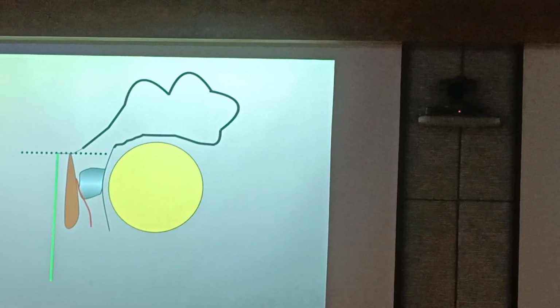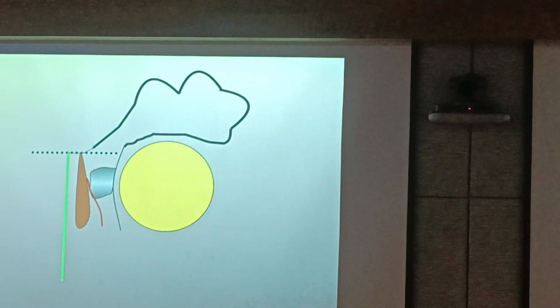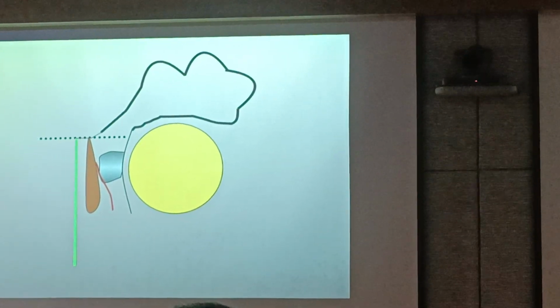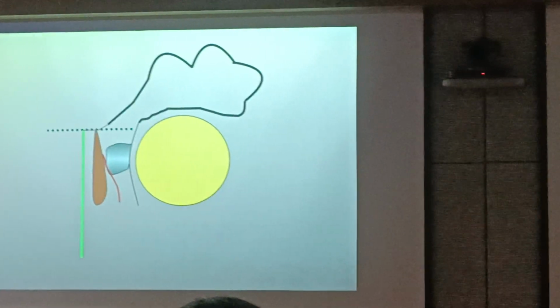Just remember one thing, that the agger and the uncinate may be fused, and so when you remove the posterior wall of the agger, you may not see the uncinate. So you should be aware that it can happen like that, and therefore you may not see the uncinate. Okay, that is in a trans-agger approach.